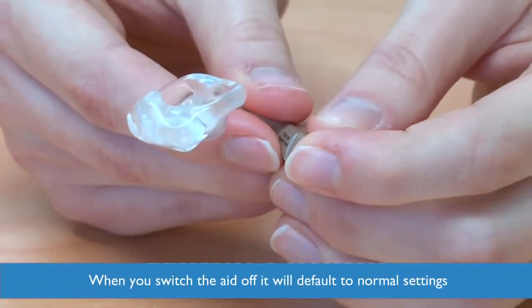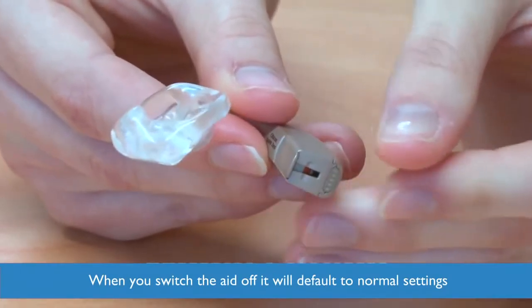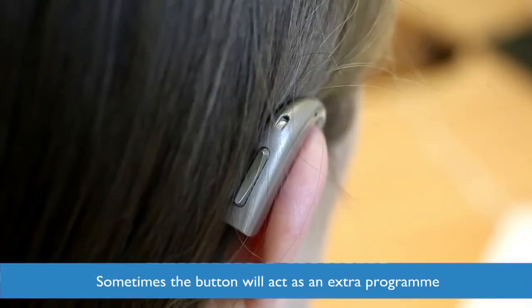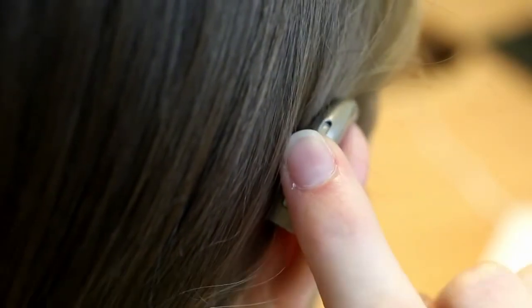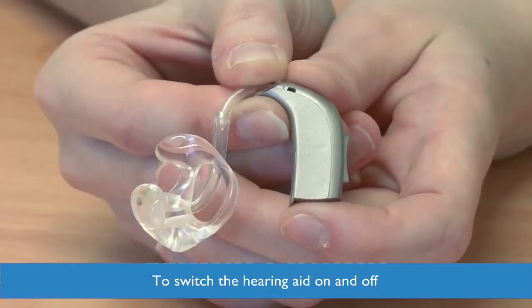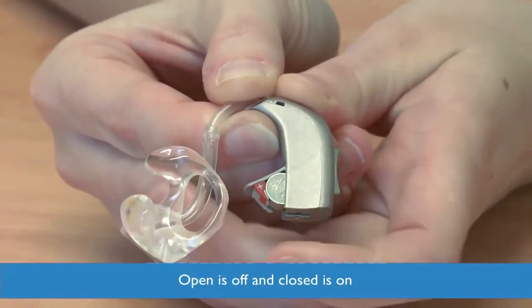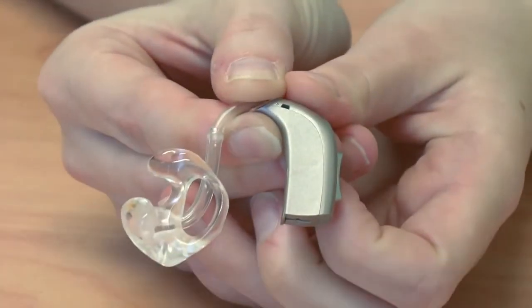Whenever you switch the hearing aid off and back on, it will default back to the normal setting. Sometimes the button may be active as both an additional program and volume control. To switch the hearing aid on and off, you open and close the battery drawer at the bottom. Open is off and closed is on.